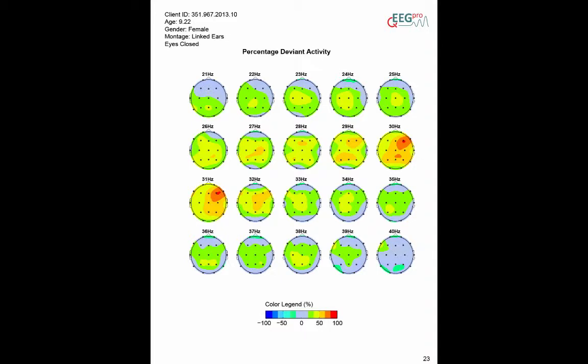When the average z-score is negative, this percentage represents the time that the power is below a z-score of minus 2.3. The color legend ranges between minus 100% and plus 100%, which refers to this dependability on the average z-score.